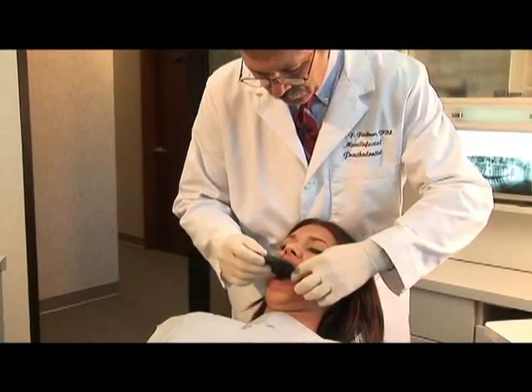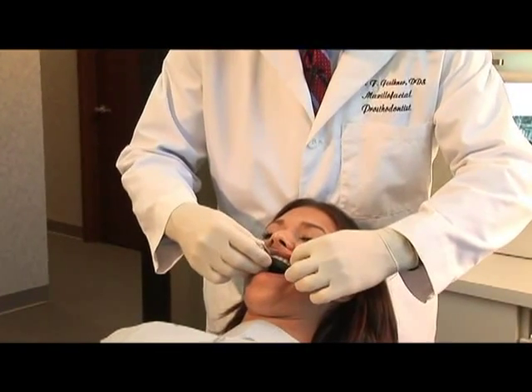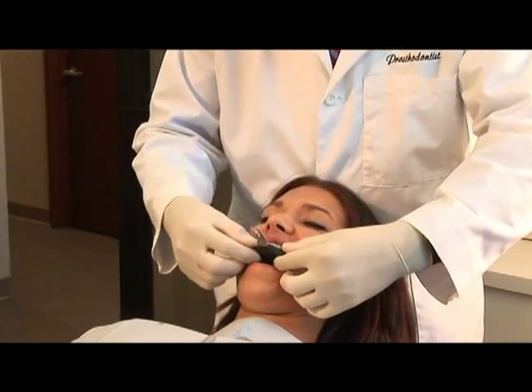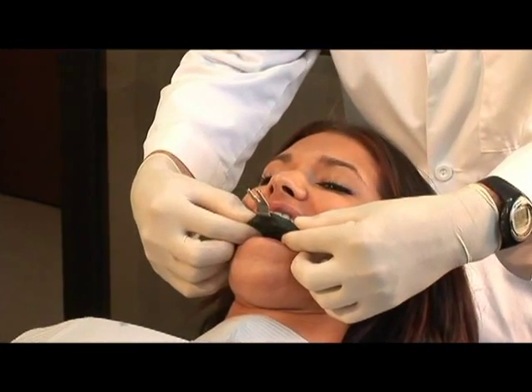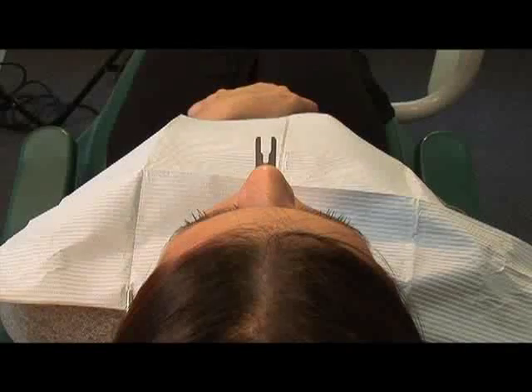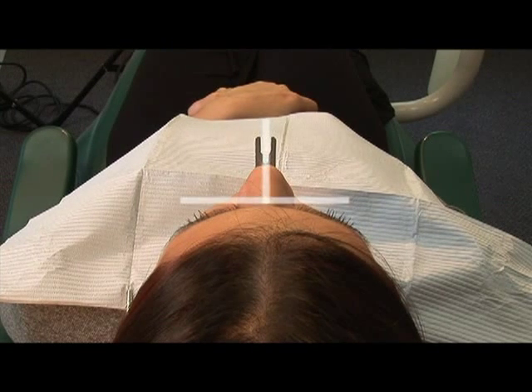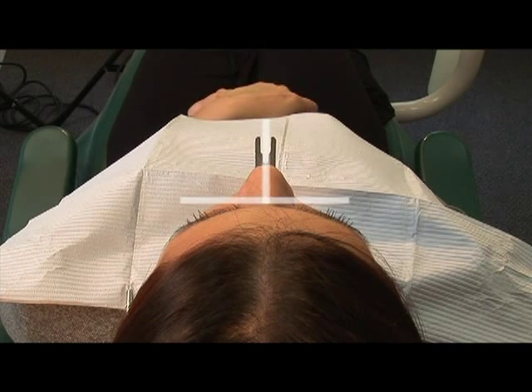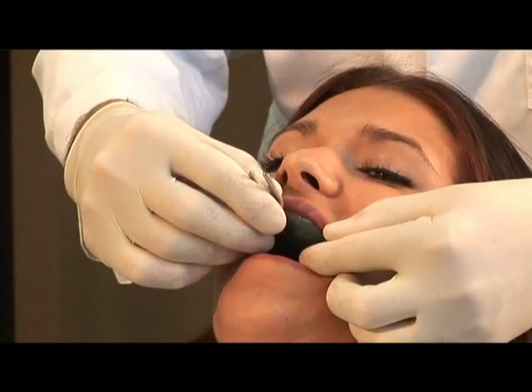Place the bite fork into the mouth. Position the fork so that the stem of the fork aligns with the facial midline, and support the fork until the material is set. The best way to check the alignment of the bite fork is to view the patient from behind. Note how the stem of the fork is aligned perpendicular with the facial plane. When the material is set, gently remove the fork.